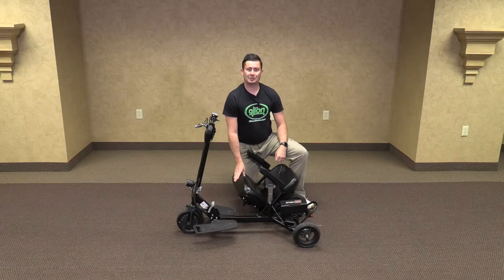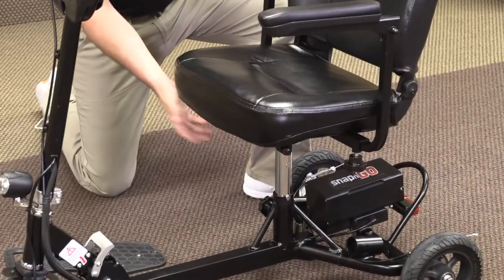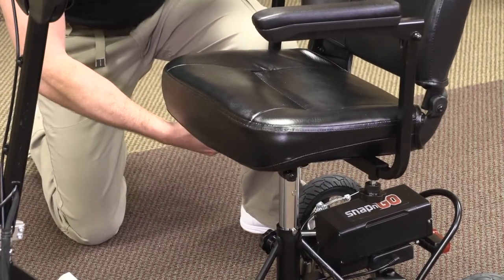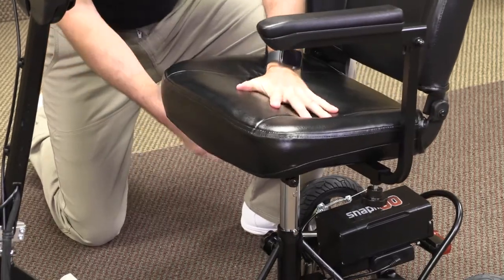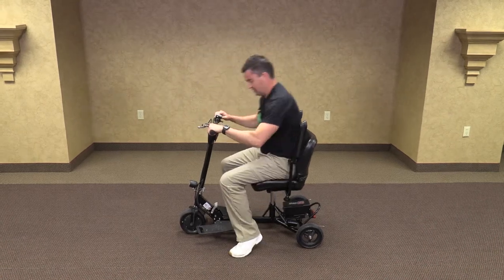Now we are going to install the seat. Lift up the seat and put the peg on the bottom of the seat onto the seat peg. When you sit it in there, it won't quite be locked into place, so you'll need to grab the swivel lever, pull it forward, rotate it, and press down until it locks in place. The arms all adjust completely — you can sit down and pull the lever and rotate.